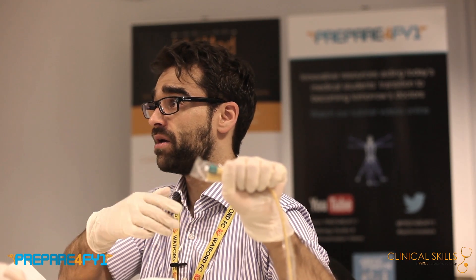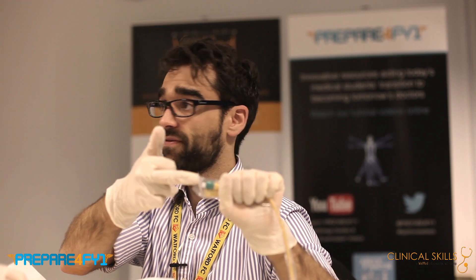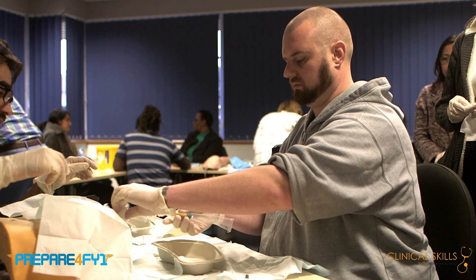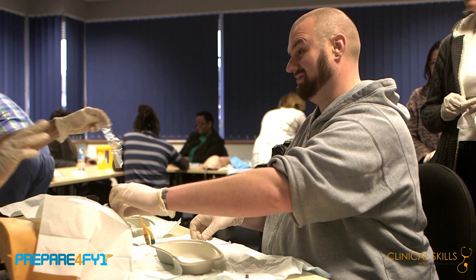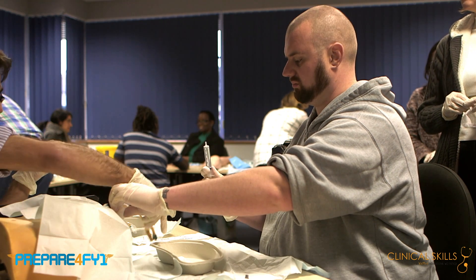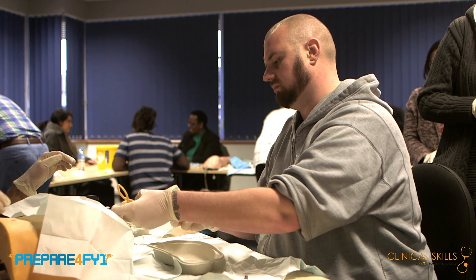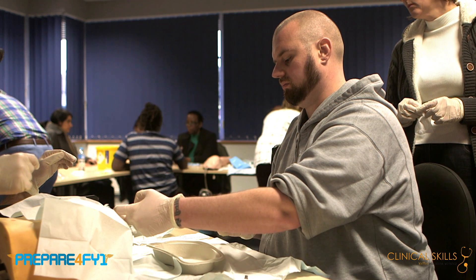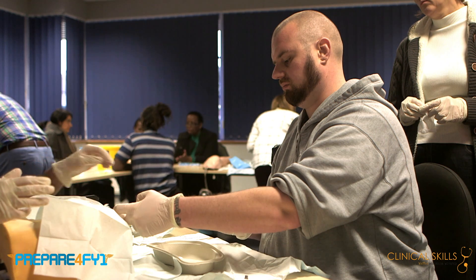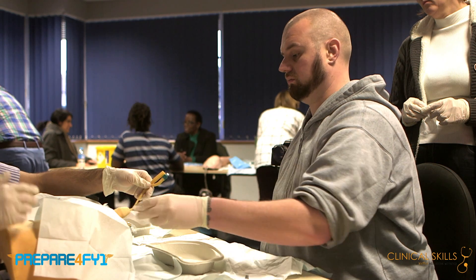In real life, put it all the way in. If you've put it all the way in and you do not get flashback, you need to get a bladder syringe, connect it, and aspirate back to get urine — and then and only then you can inflate the balloon. Empty the plastic sleeve, connect to the port, and fill the balloon. Any pressure or pain, stop. Keep pressure on the syringe before you undo it, and then connect this to your catheter bag.